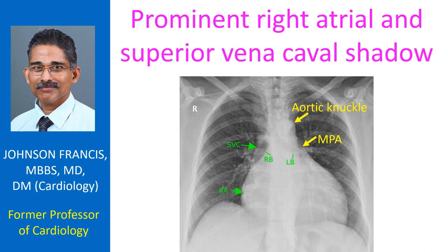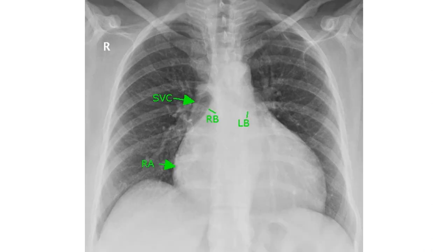The main pulmonary artery segment is visible below the aortic knuckle as a little bulge beyond the left cardiac border. The aortic knuckle is considered the first mogul and the pulmonary artery the second mogul on the left cardiac border. If the left atrial appendage is prominent, it becomes the third mogul sign.